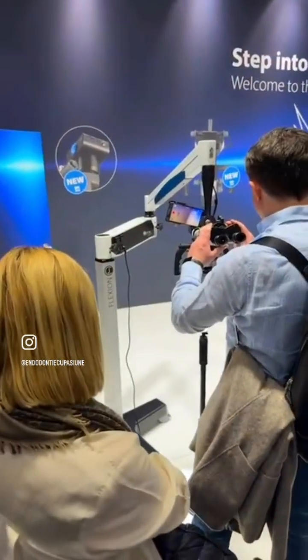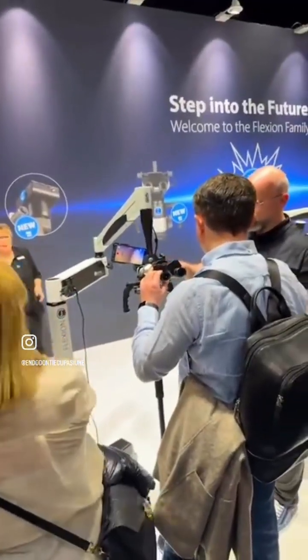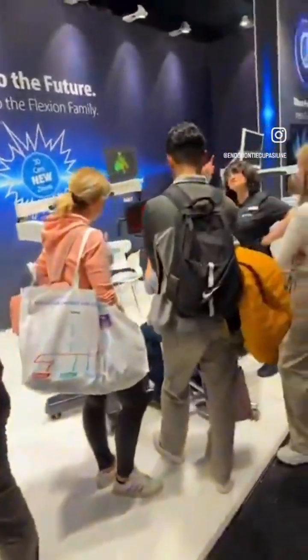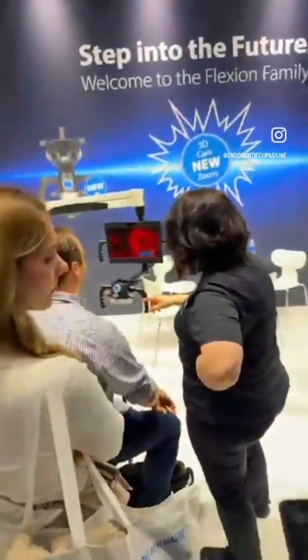Right now we're at Karsten Jung and they have some really great stuff here. Obviously everybody knows the CG Optic microscopes — you all know the Flexion, which is quite a staple in terms of good quality dental microscopes. But now we have something really amazing, which is the new 3D microscope.